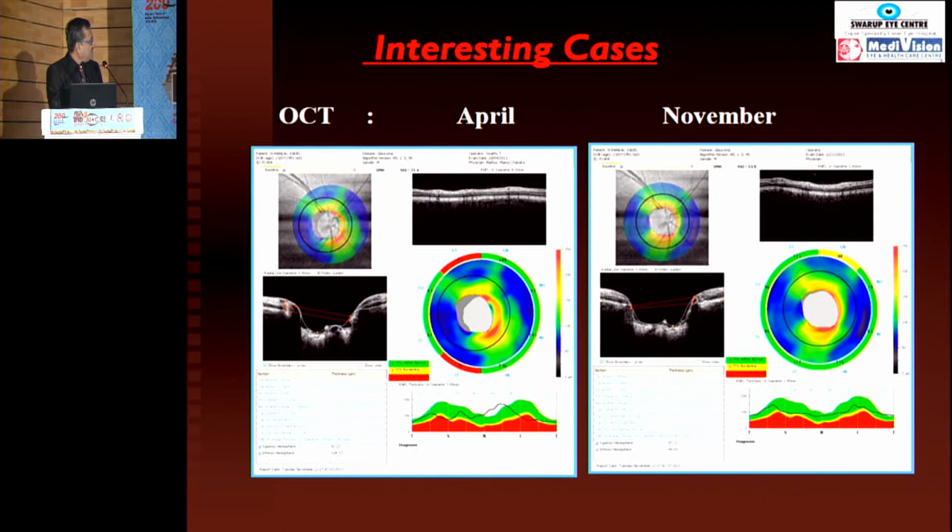Here, the OCT was absolutely normal. If you see here, what is it? The disc is absolutely centered. Whereas here, I got the superior temporal defect only because the disc is decentered. Instead of checking the thickness here, the thickness is checked here.